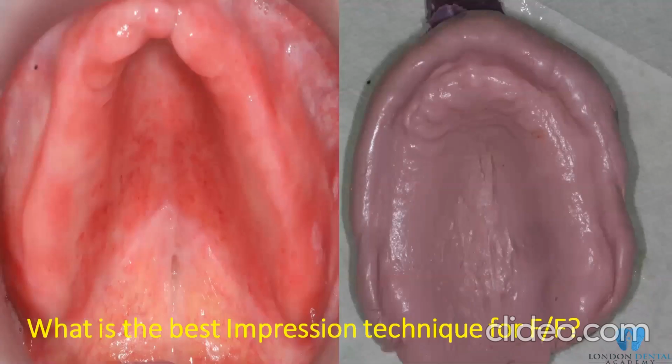Again, this guy, Jack, I think I saw him back again in 2011-12. He had some anterior teeth, and as you can see, the alveolar ridge and the palate are quite red, and most of you would agree that this patient has denture stomatitis. And most of you would agree that this patient is most likely wearing the denture during the night.